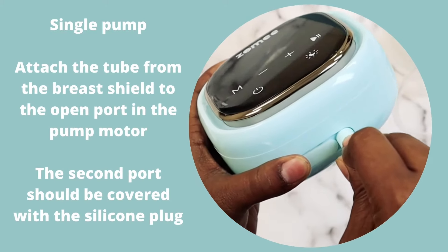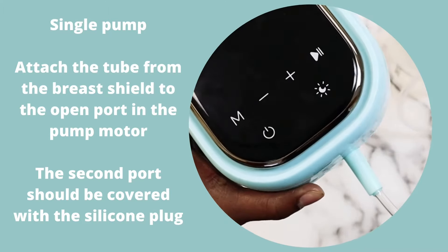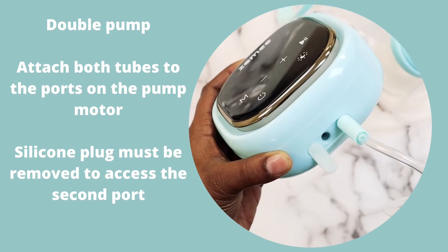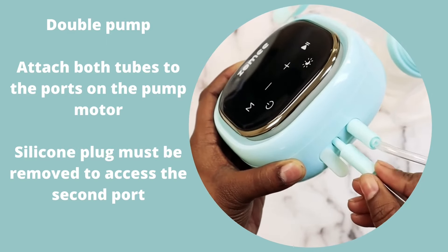Attach the tube from the breast shield to the open port in the pump motor. Attach both tubes to the ports on the pump motor.